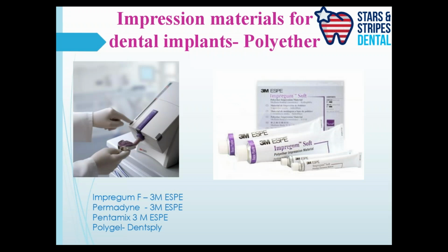3M has come out with something called Pentamix, which is an even more sophisticated device which has everything pre-mixed. So you just press the button. It is automated, so it's not manual. On just a finger touch, the material is removed from its respective tubes, it is pre-mixed, and then you can load your tray directly. It's called Pentamix. Of course, it's very, very expensive, but it's great. 3M has this dispensing system only for the polyether.